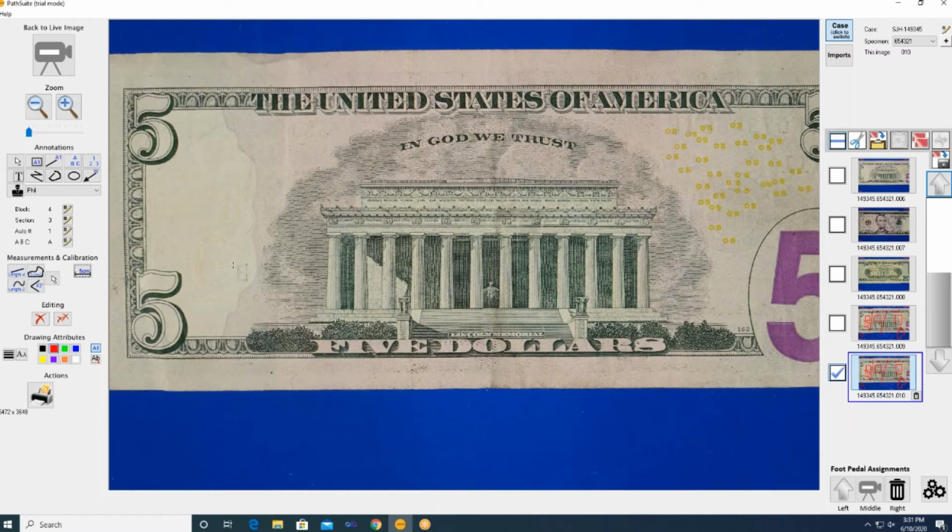So I've cleaned up the image, and the next thing that's really fun to do is to come in here and start doing measurements. And I might want to measure from here to there, and I will go grab my measurement and position my measurements where I want them. I can measure areas, so I may want to say, okay, what's this area right here? And it'll measure the area for me. Or, let's say I have a colon or a small intestine and it's kind of curly. I can actually measure the distance down the center line and it'll give me the length there. Okay? And grab that.